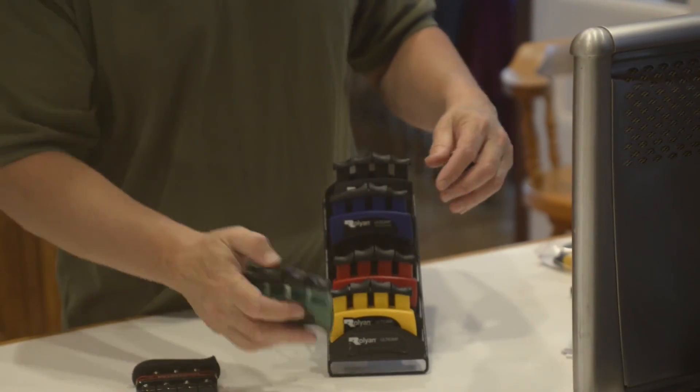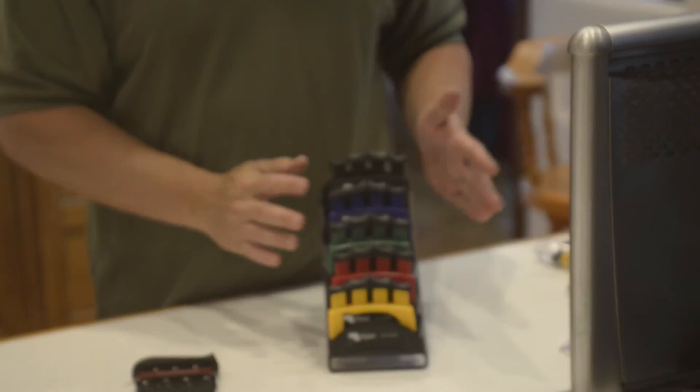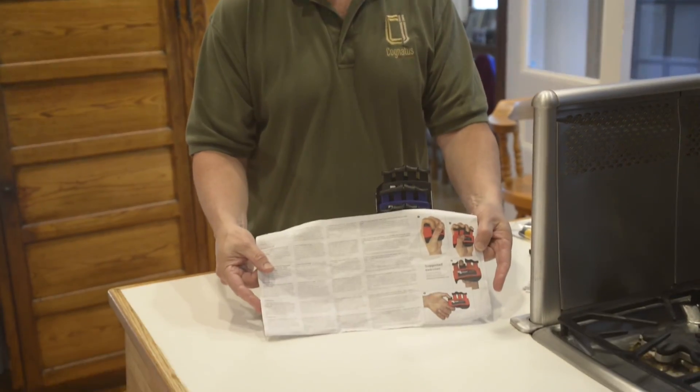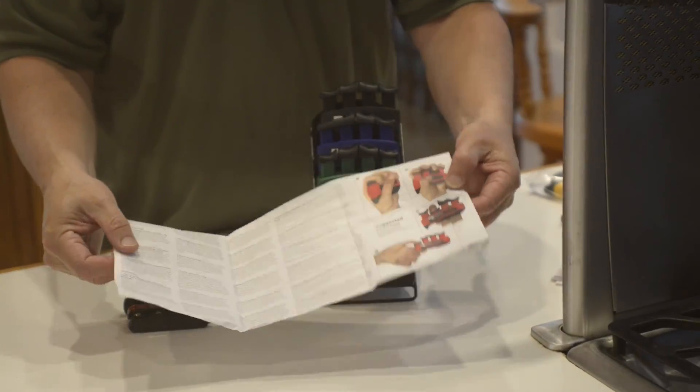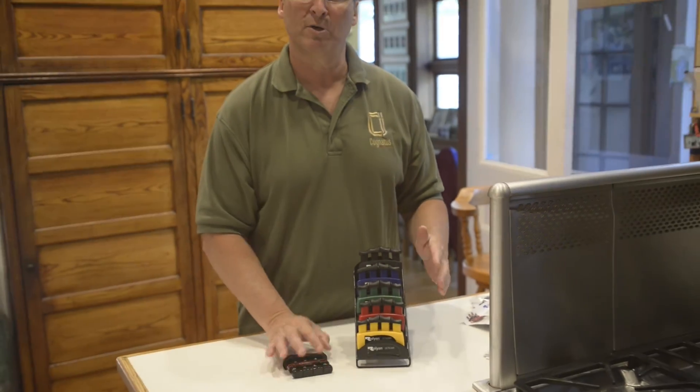This is sold the same way — the same five strengths as the DigiFlex. If you buy all five, you get the stand. Each one comes with colored instructions with suggested exercises. And the price in the catalog is actually a little bit less than the DigiFlex, so you guys can take advantage.